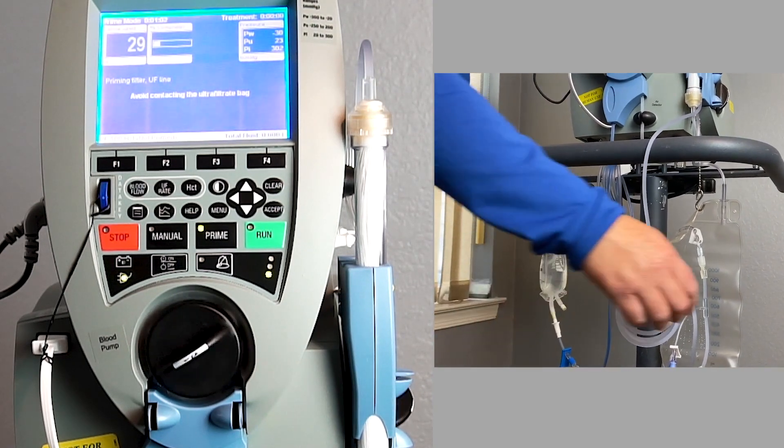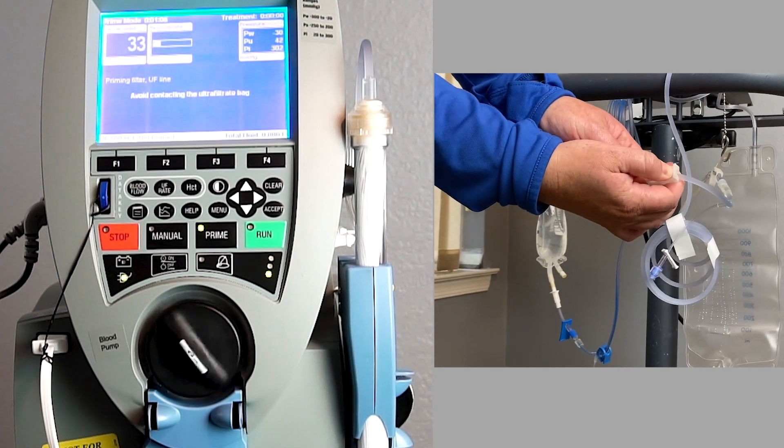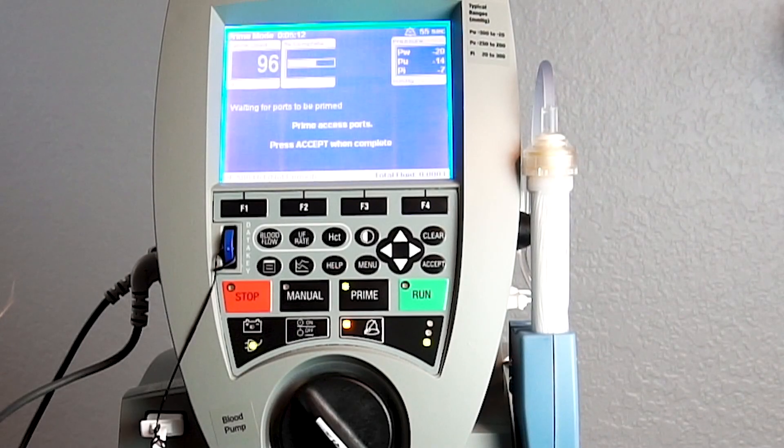When prompted, clamp the infusion line using the large clamp on the clear line connected to the UF bag. Release the infusion line clamp when told to do so, and then prime the access ports.